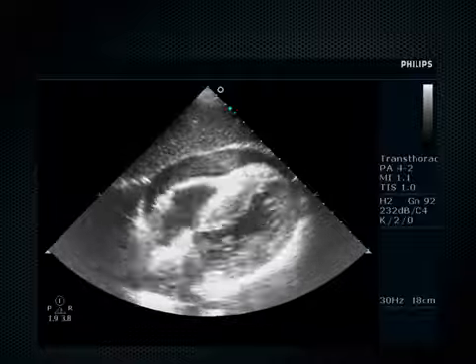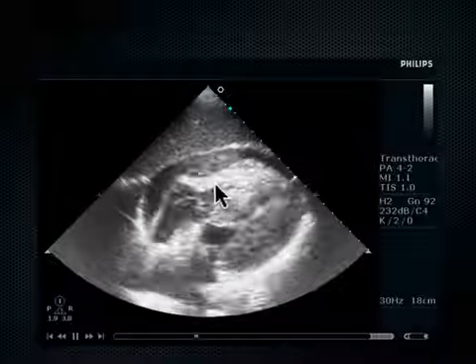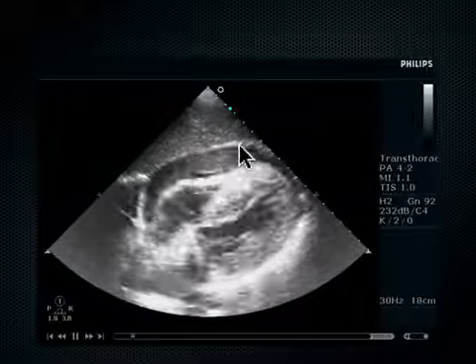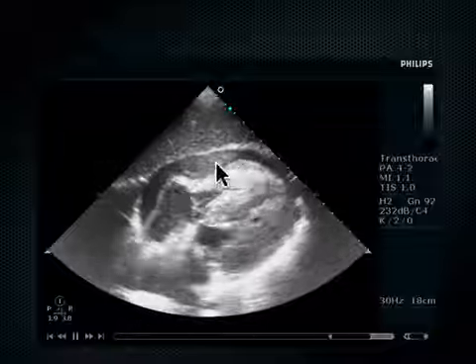This is what it looks like, though, if you have a clot. This is a patient with pericardial tamponade. Why do I say that? Look at the RV. It's bouncing up and down like it's a trampoline. Somebody's jumping up and down on it. This is the pericardium seen out here, and this is echogenic material here that is clot.